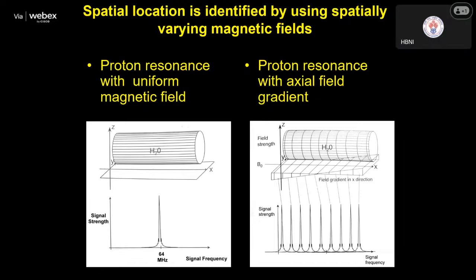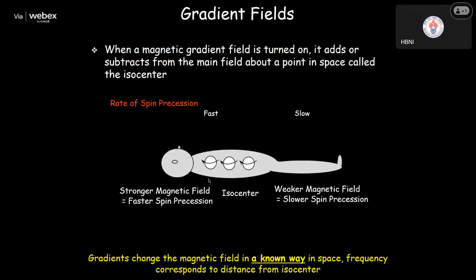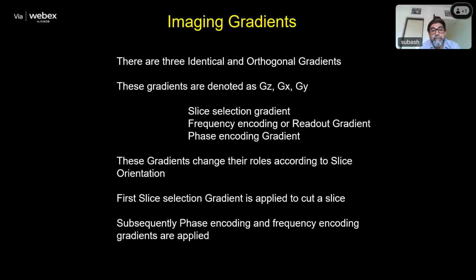Okay. So now, same, we are applying a gradient magnetic field. This is the body. This is a person, say in lying position. You can see when you apply a gradient field, you can make some spins move faster, some move slower, and accordingly you will have different locations in this body with spins of different resonance frequencies, which can be picked up later by different techniques.